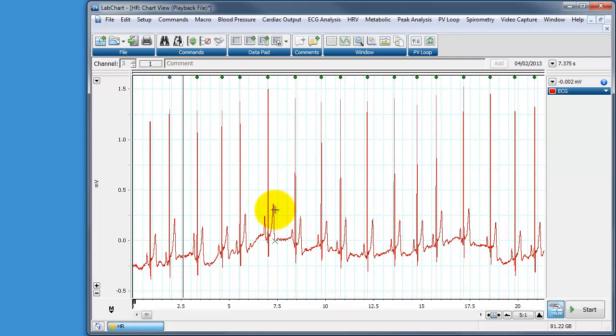Of course if you're using LabChart Pro you have access to the HRV or heart rate variability module which allows you to do this sort of analysis automatically, but for the demonstration we're doing here using a macro we can do this ourselves without using the HRV analysis tool that comes with the Pro version.